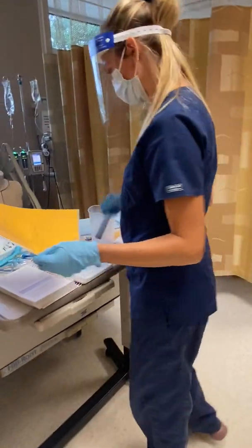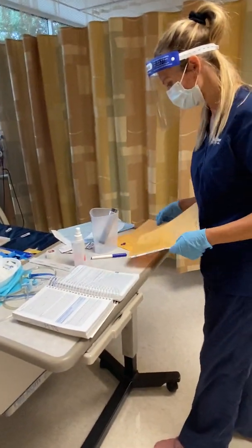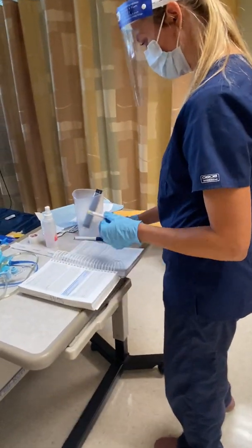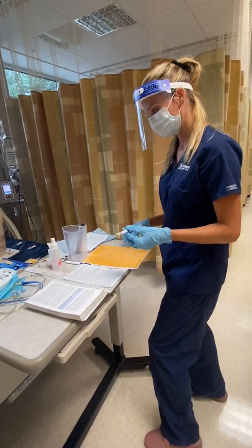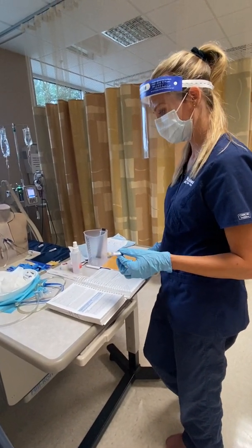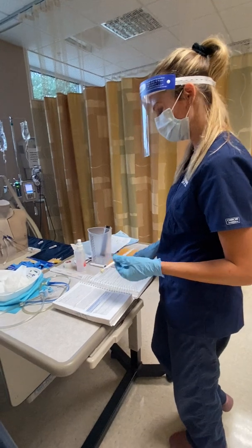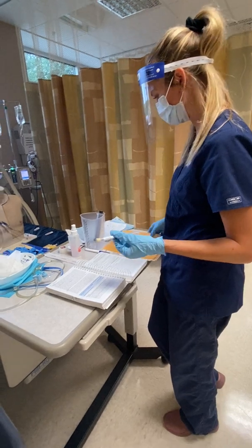Okay, so I've brought my Zofran in to the room, and just double checking my chart. I checked in the Betty book for giving an IV push of Zofran, and this can be given undiluted, and we can give this push over a 2 to 5 minute time span. So just checking, making sure, like I said before, if she had an allergy to it, we wouldn't be giving this to her, but she does not have an allergy to this.